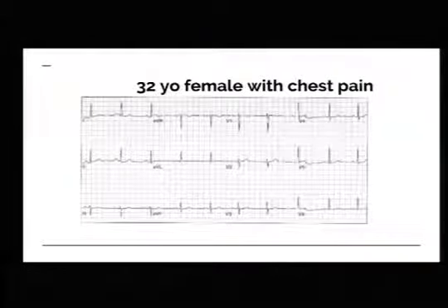What's your rate? Is it normal, fast, slow? So 1, 2, 3, 4, 5. What's 300 divided by 5? So, normal rate, right?